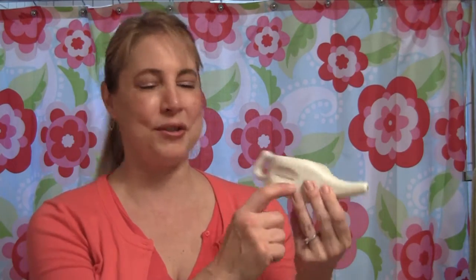Now, a Neti Pot actually looks like this. It's actually a little pot. This one is made out of plastic, super cool. It's from one of the local drugstores, and you can buy this as a part of a kit. If you've never done a Neti Pot before and you're not sure quite how to get started, you just buy it all as a set. It's going to have a little spoon to help you measure out the amount of ingredients that you need. It's going to have a pre-measured salt packet. You just mix it with water and you're good to go. I'm going to show you the items that would come in that packet.